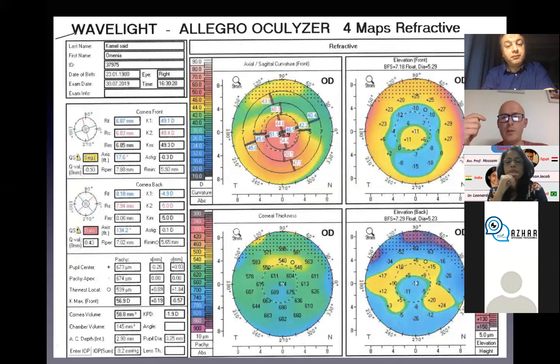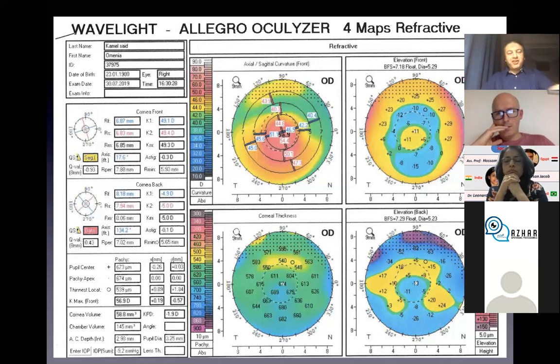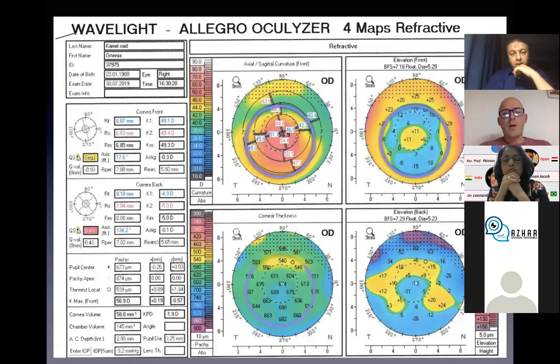What do you think? If I found a cornea thicker than 650 or 700 even, would I do a LASIK for her? It's a good note about the thickness, Leonardo. I would get an anterior segment OCT. Maybe this patient has something below the flap or in the interface, because it seems that there is an ectasia in a very thick cornea.